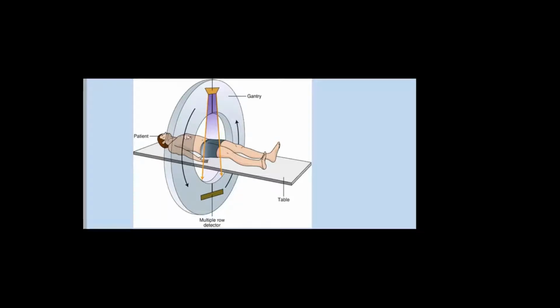CT of the brain and the abdominal structures has been there since antiquity, but cardiac CT started in the late 70s, early 80s and evolved rapidly in the 90s and 2000. It took time because we are scanning a moving structure.